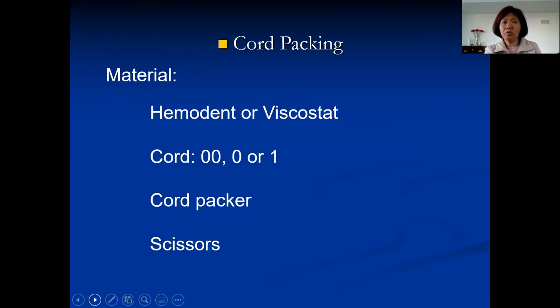For packing cord, you need hemodon or viscostat. Our school used to have both; recently we only have hemodon. I personally like viscostat better — it stops bleeding a little better. It's iron sulfate. I tell the patient it's an iron sulfate supplement: it tastes horrible but it's good for your health, so they usually accept that. Hemodon is aluminum chloride and not as effective as the iron supplement.